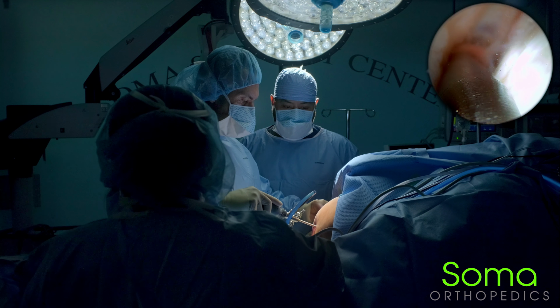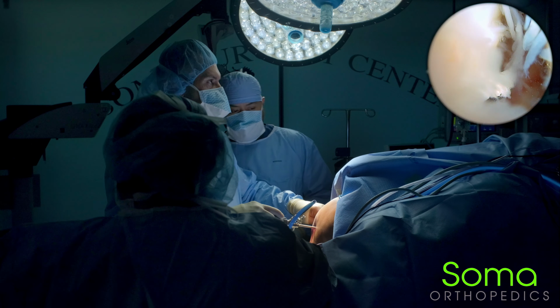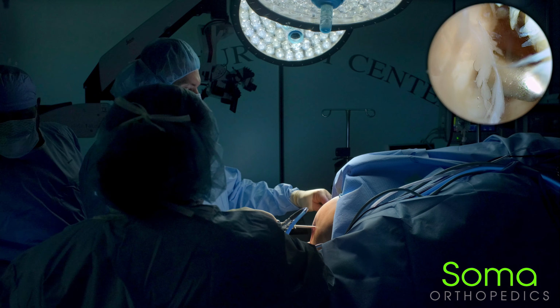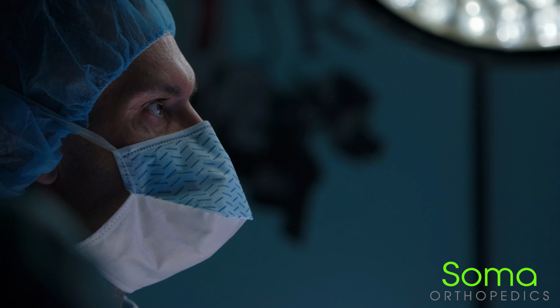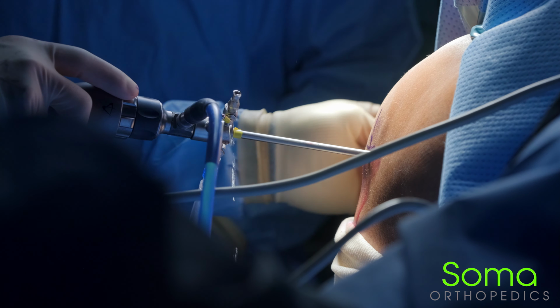In a meniscus surgery like I have today in this patient, what we're doing is finding the tear and deciding if it requires repair or just clean out. Typically, most of these tears in the meniscus will be just cleaned or debrided back to sort of smooth lines.